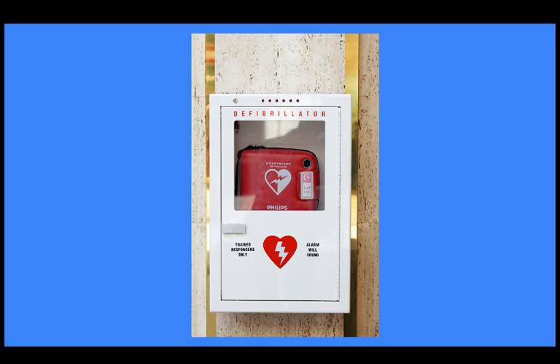Be sure to move the person and yourself to a safe place before using the AED. Electricity and water can be lethal when combined. Ensure that the person is not wet, quickly wipe dry, or in close proximity to water before using the AED. It is safe to use an AED if the person is lying in snow.